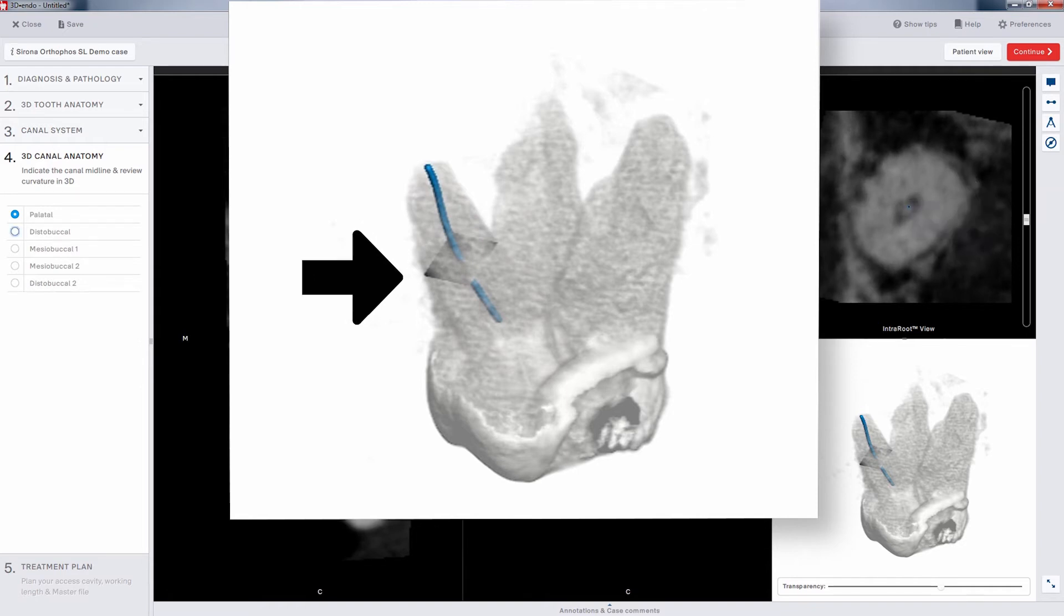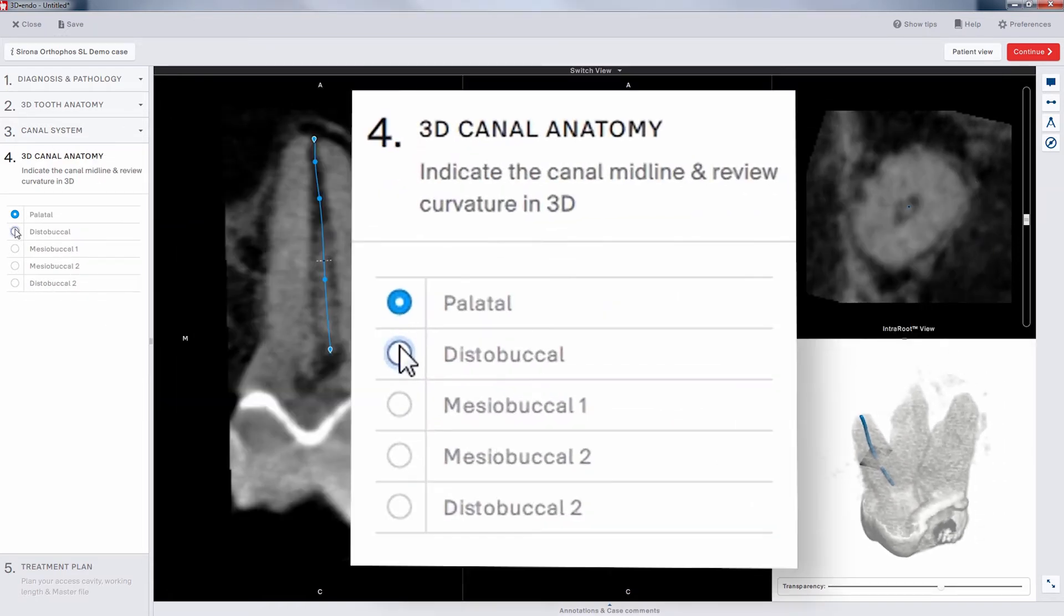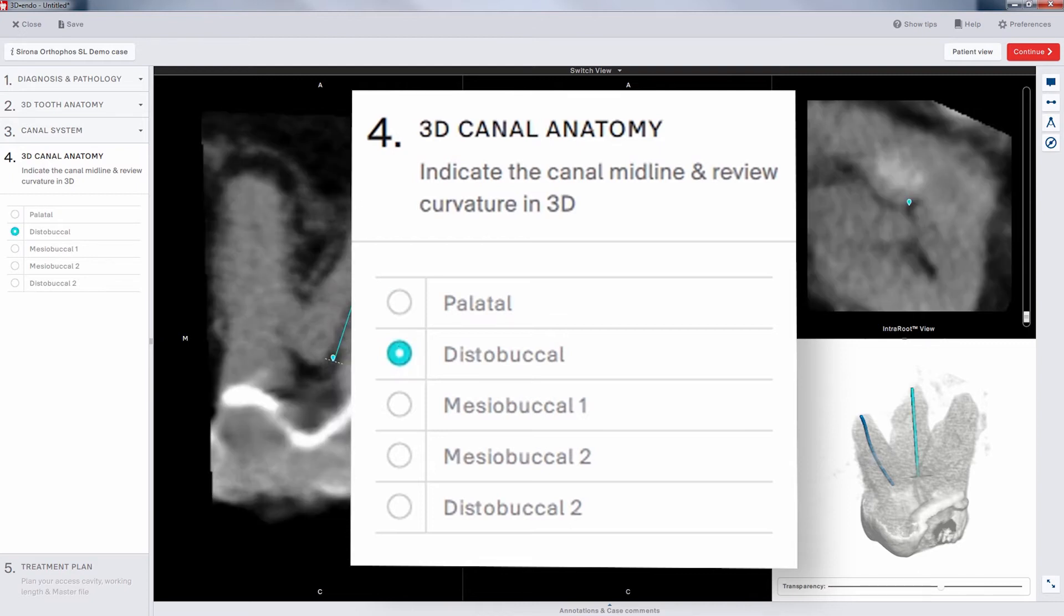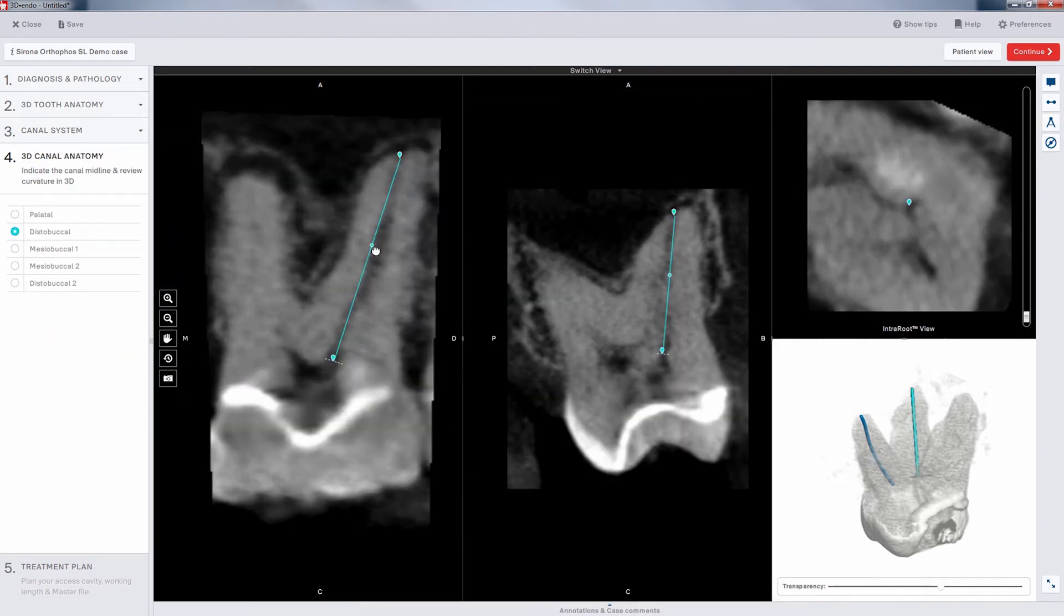When you are satisfied with your trajectory, simply go back to the left-side menu, click on the next canal name, and repeat the process.